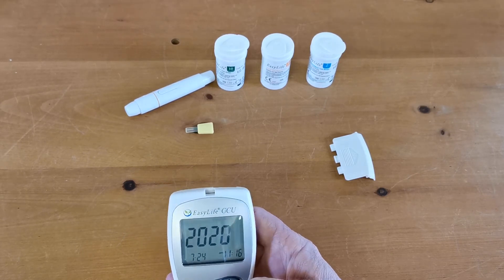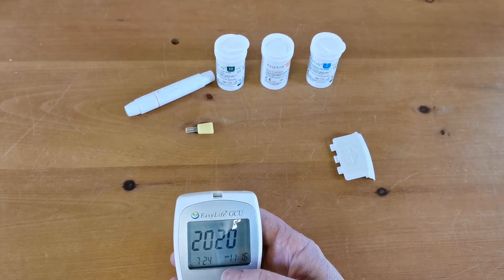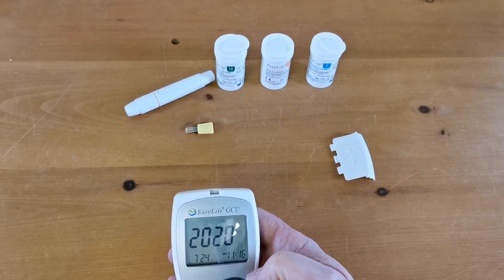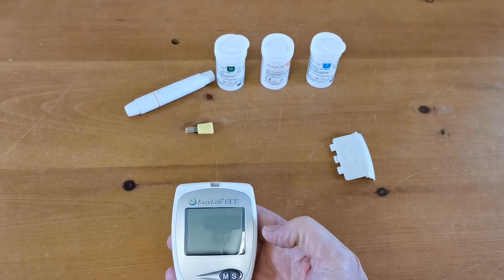So we've set the date and time as the year 2020, the month July the 24th, and the time 16 minutes past 11am in the morning. Then all you need to do is just wait for it to time out.